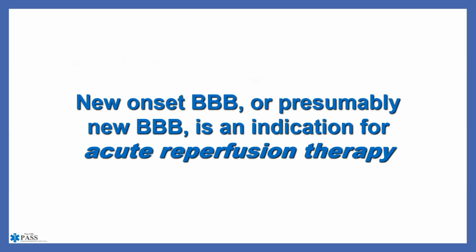A new or presumably new bundle branch block is an indication for acute reperfusion therapy. So here's the deal. We don't have the luxury in the field of knowing whether it is new or old or getting an old EKG. The only way that you would know that is if you've made prior calls on that individual and you just remember what it looked like.